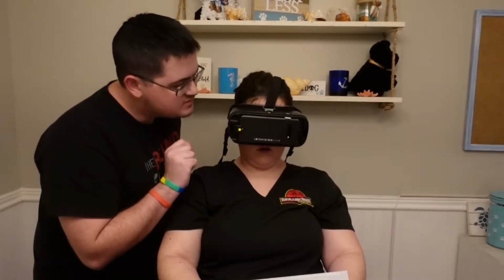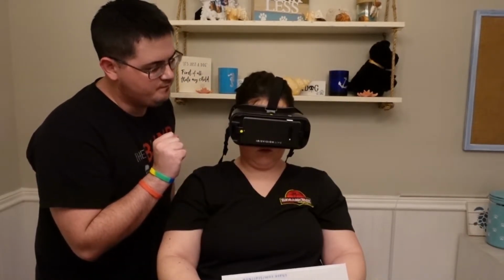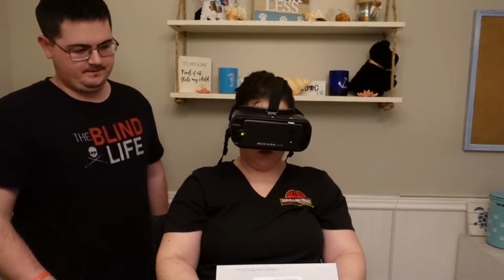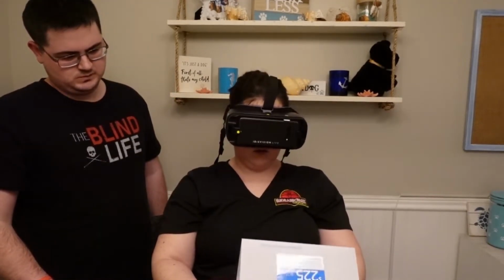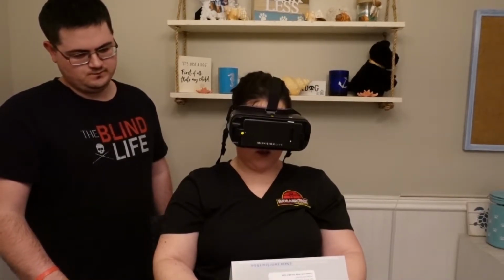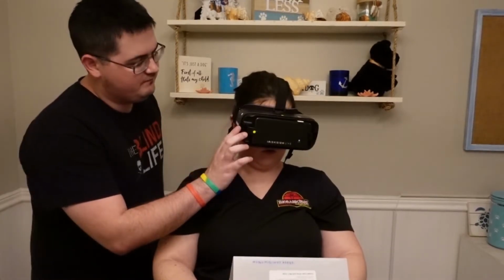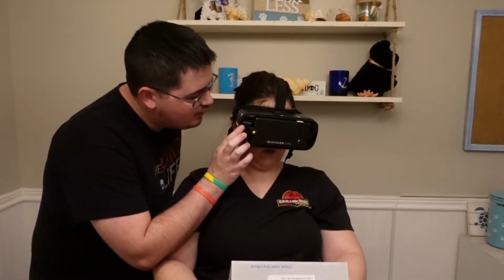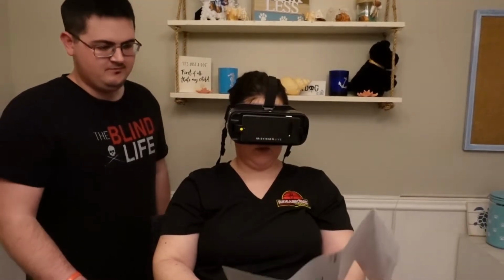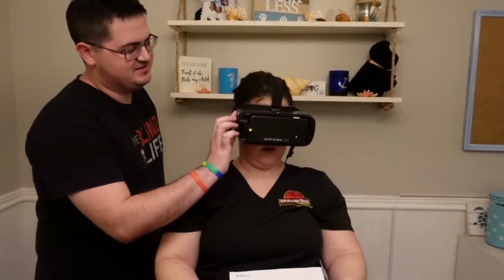Maybe. Set zoom at 5. Setting magnification at 5. All right. Shoot, I can't see that. It's tiny. I can see the words and stuff, it's just not readable. Let's try, set zoom at 12. Setting magnification at 12. That's like too much. I can't even see the paper now. So then let's go back to 2.